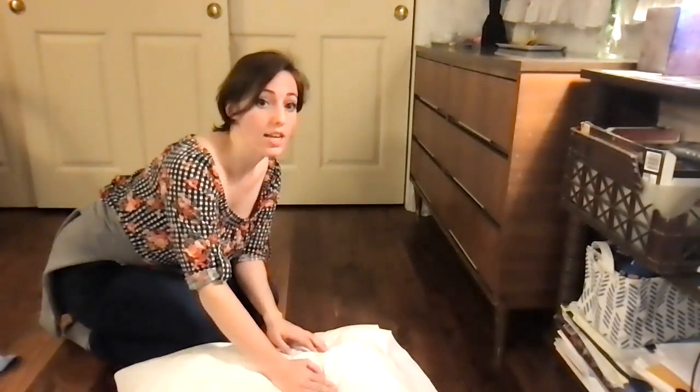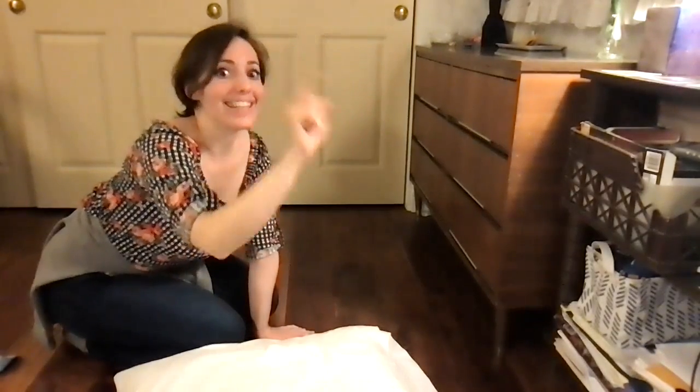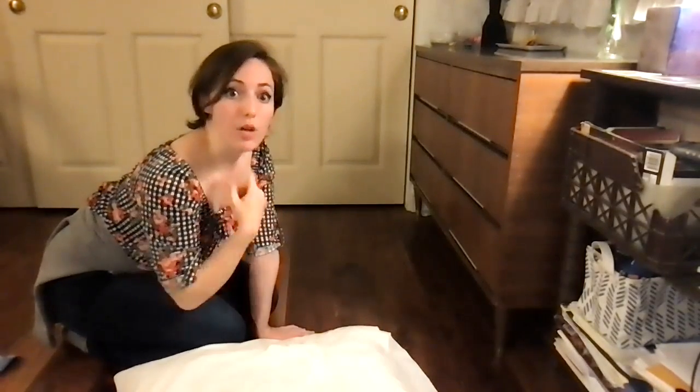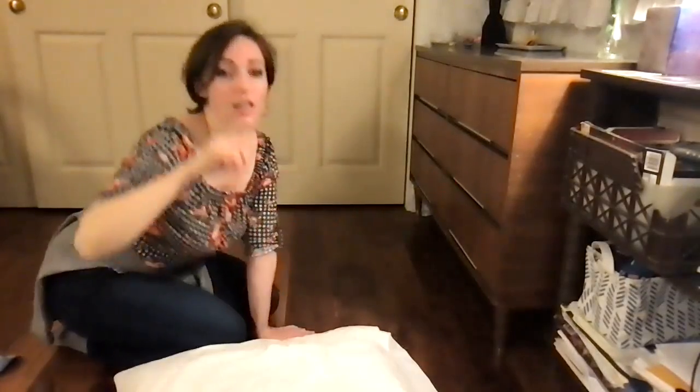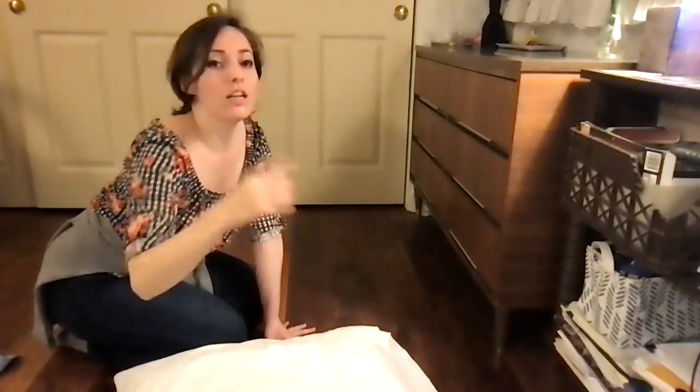So what you're going to do is tap, see if the person's awake. If they're not, you're going to point to somebody and say, hey, you, call 911, tell them that this person is unconscious, needs an ambulance, and get back to me. Tell them to get back to you so you know it's been done, so you know that they didn't have any issues, like maybe bad service or something. Then you point to somebody else and say, you get me an AED and then come back.